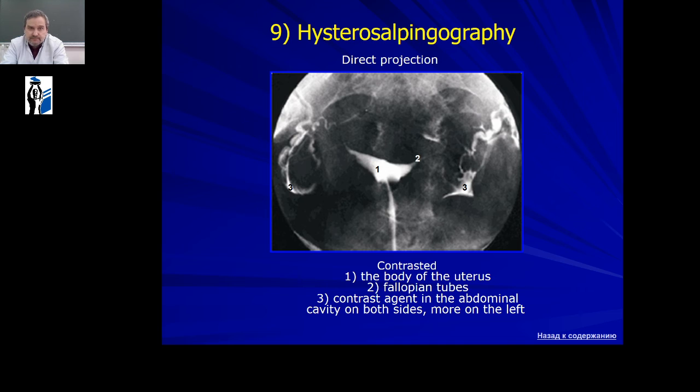The next sample, hysterosalpingography in direct projection. This is contrast examination.